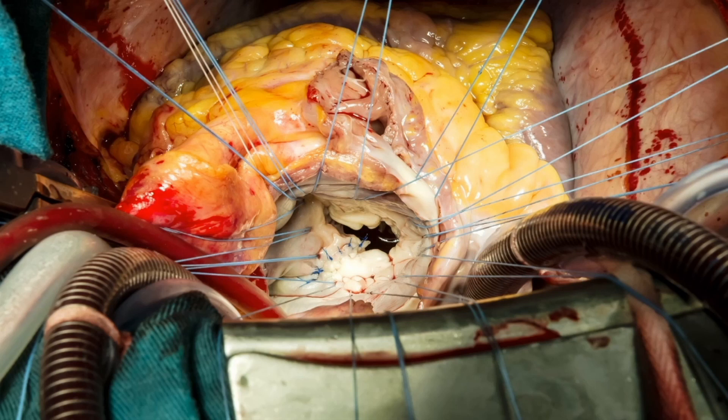Transesophageal echo is an excellent imaging modality for assessing the structure and function of the mitral valve because in most TE views the mitral valve is relatively close to the transducer.